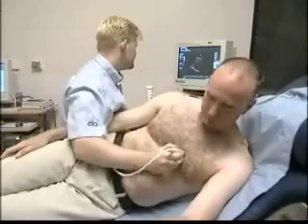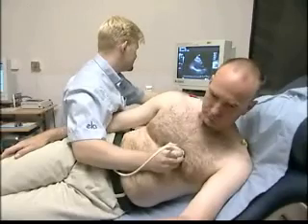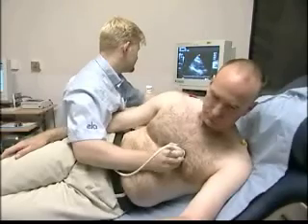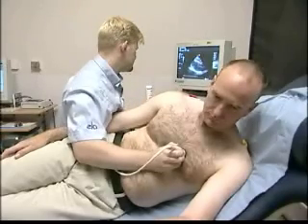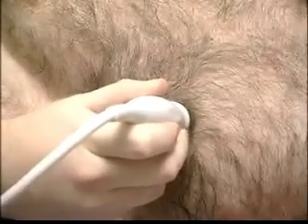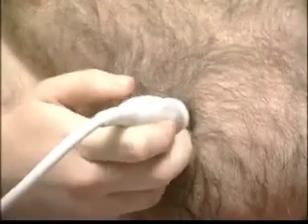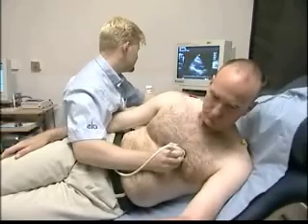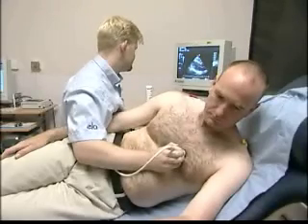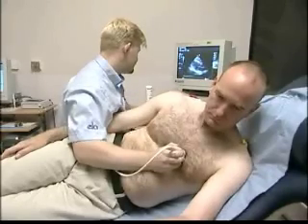Ultrasound is useful for rapid and reliable cardiac investigations, particularly as it's the only technique that can provide information about blood flow. As ultrasound doesn't penetrate bone, the transducer has to be shaped so the ultrasound beam passes between the ribs. The wideband transducer used transmits at 1.75 MHz for good penetration, and images are formed by detecting the reflected second harmonic at 3.5 MHz, giving a good compromise between spatial resolution and sensitivity.